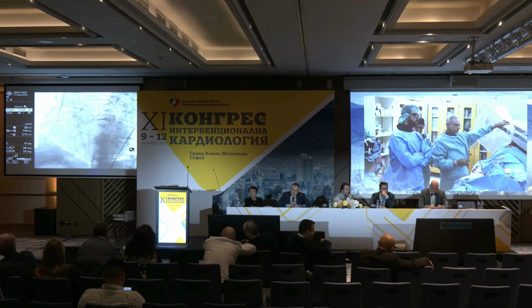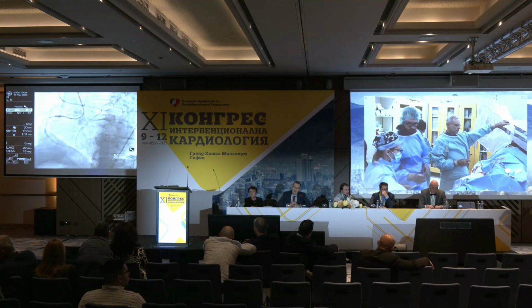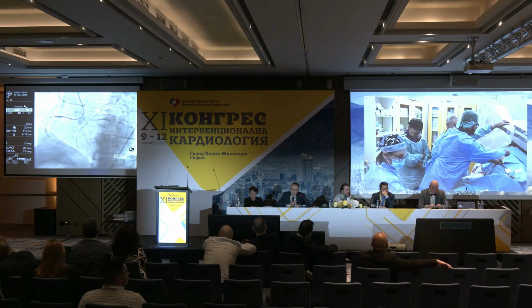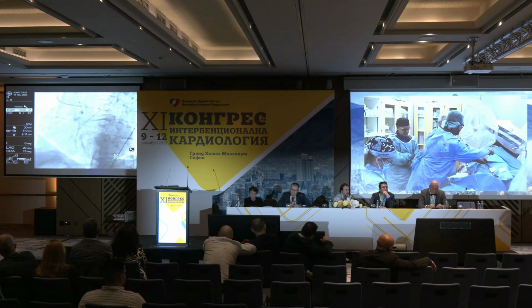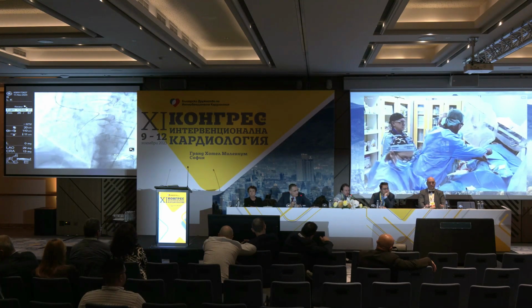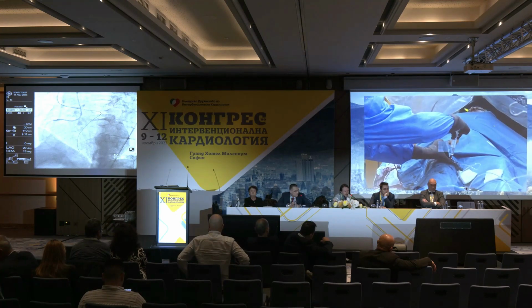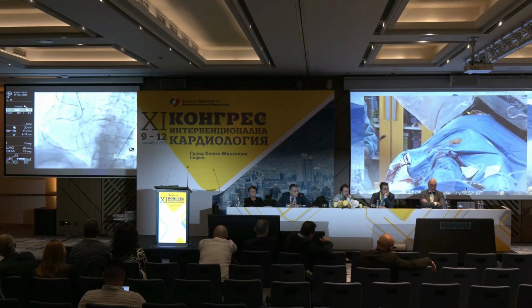Absolutely. Yeah, but we are sure that you crossed true to true because you were already sitting in the true lumen antegradely, and your wire passed while your guiding catheter was very deep in the proximal RCA. The second, going into the guiding catheter with your run through, it went smoothly, so you didn't hit anything there. Yeah. My concern about the IVUS in this case is only because of the distal diameter of the vessel; probably there is some aneurysm there. It looks like that, and it would be useful for stent sizing. If you have any comments until now or something that needs to be discussed.